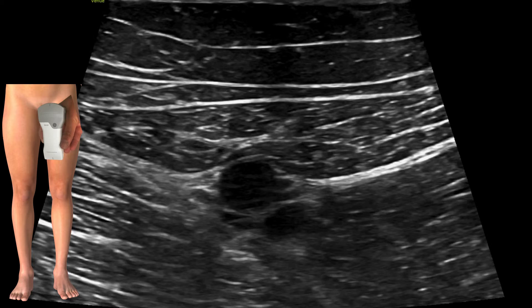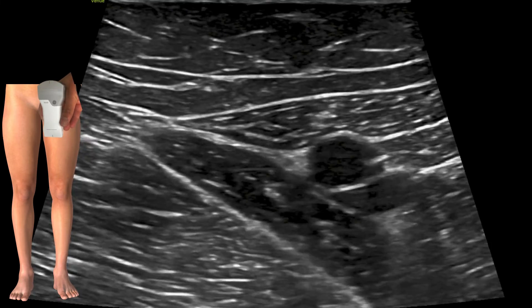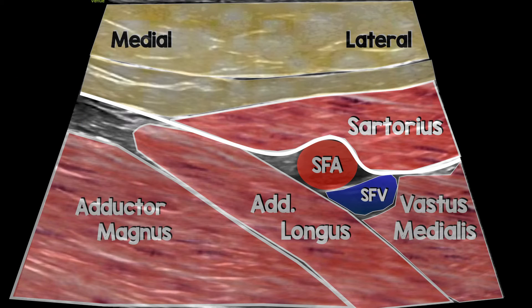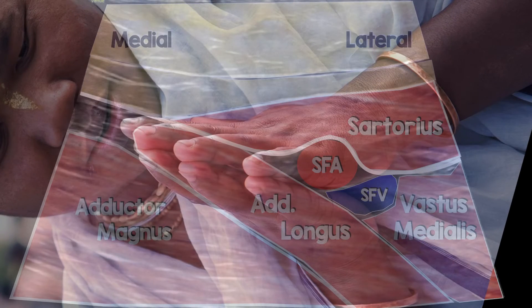Let me add an anatomical overlay. At the apex of the femoral triangle we have sartorius, adductor longus, adductor magnus deep to that, vastus medialis on the right, and the superficial femoral artery and vein. The apex is at that medial intersection of the two muscles. And about that prayer sign — you can see how the two hands of the prayer sign mimic adductor longus and sartorius.